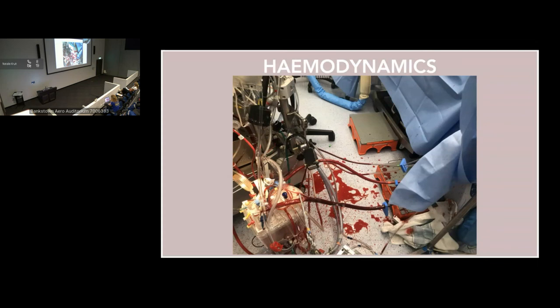Their blood pressure also has a tendency to dip, and they tend to have a systemic inflammatory response to the circuit. So having some metaraminol on hand or even some noradrenaline online is useful too. You may also be asked to give a 5,000 unit heparin bolus as well.